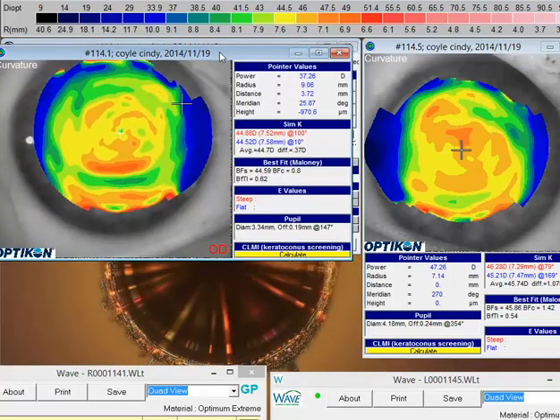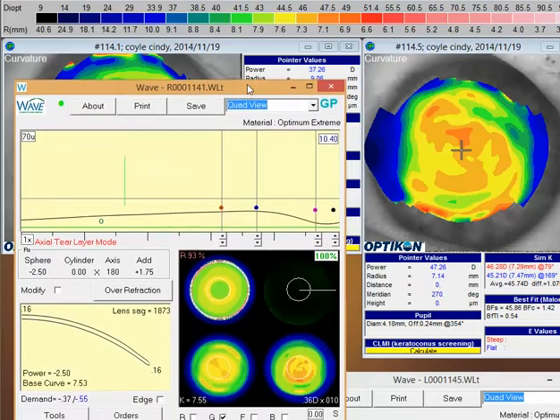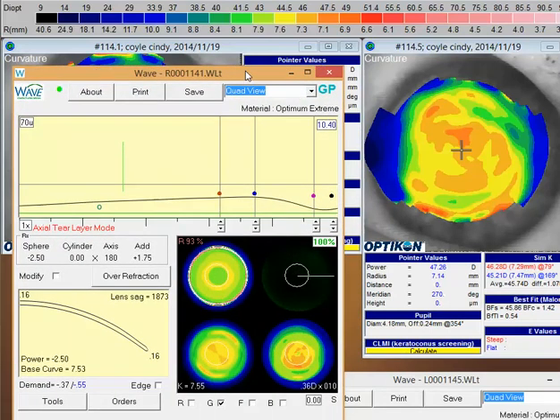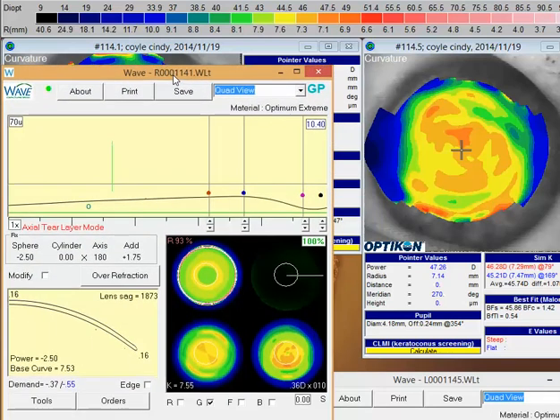But if we go back to the actual lens here, actual topography in the lens. So now let's talk about the lens design itself. You mentioned from your clinical request that the lenses are centering well but fitting rather tightly out in the periphery. And you can actually see that here. If we're looking at this design, now keep in mind we go back to the topography. We have pretty good data in this horizontal meridian. So if you had to work with this kind of topography, I would concentrate on making sure you get this lens aligned well in this horizontal meridian and not be as concerned about what the wave design looks like in that vertical meridian.